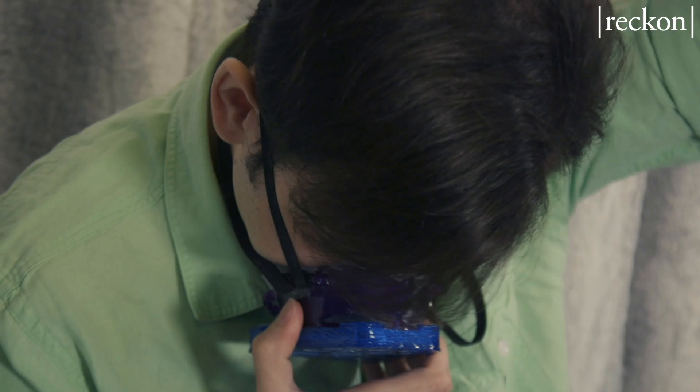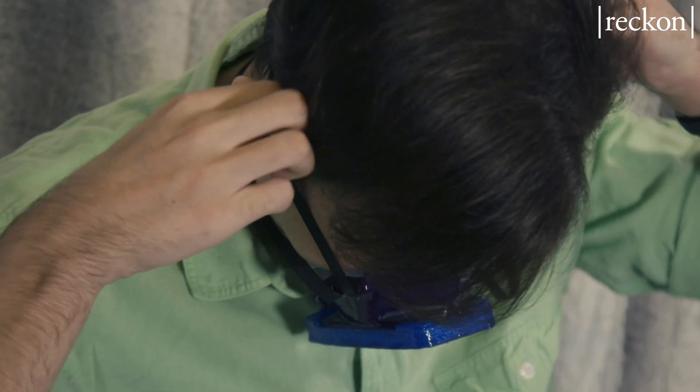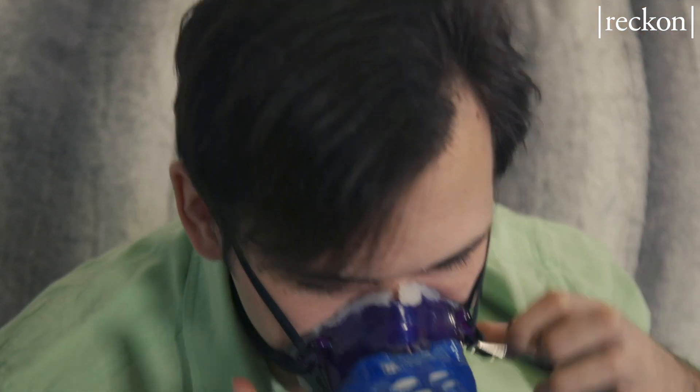These straps have a buckle that allows you to shorten and lengthen them, similar to this earlier prototype I have here. In order to put it on, just tighten that buckle, move the strap up here, tighten that buckle. There you go — full seal.